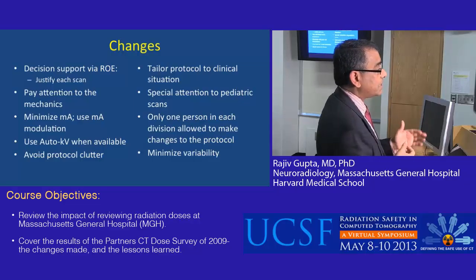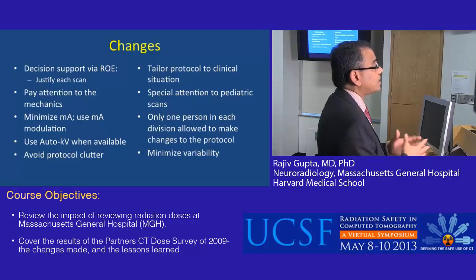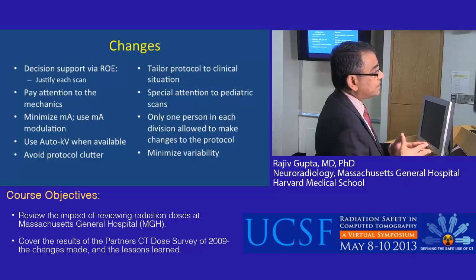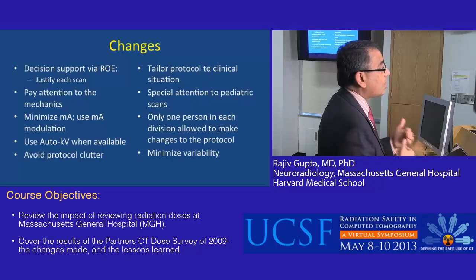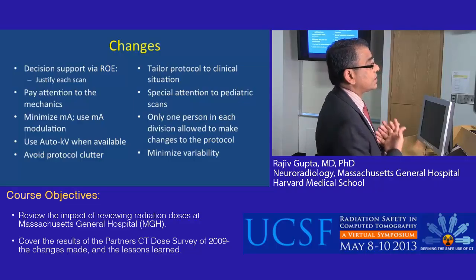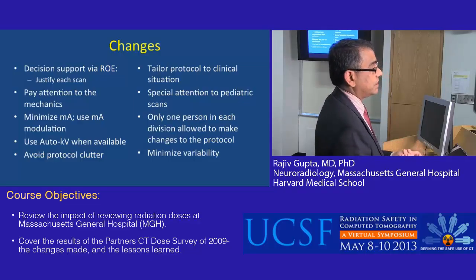So if you order a head CT for a minor trauma with no loss of consciousness, the system will tell you what the level of evidence is that the scan you're ordering is correct. And we immediately saw an effect: most clinicians would hold off on a scan if there was not good clinical evidence that the scan would be efficacious in finding the diagnosis that they were after.